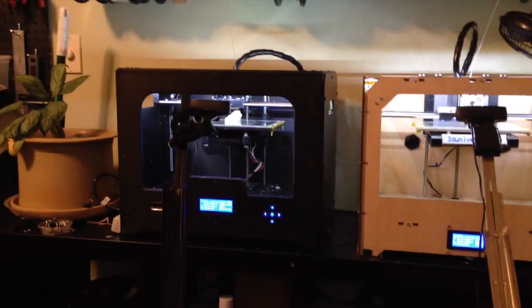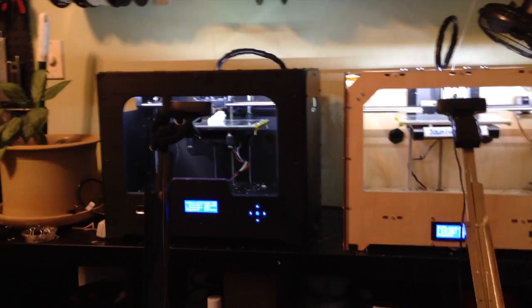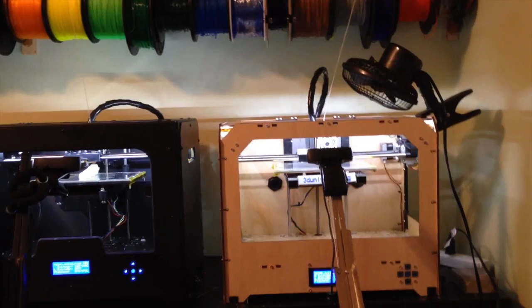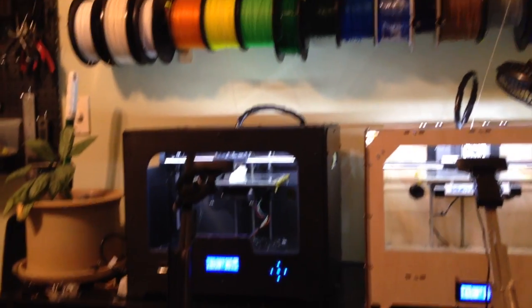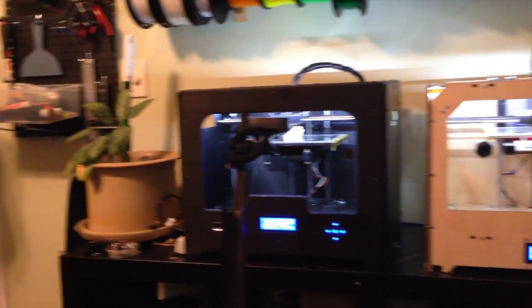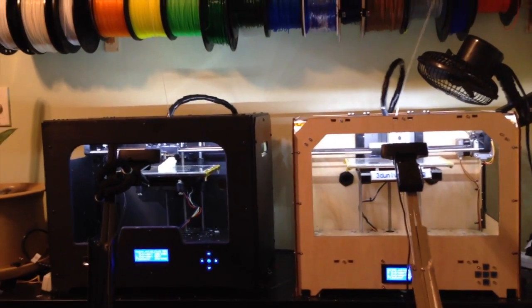Hi everyone, this is Jeremy Simon with 3D Universe. I was just doing a quick test here and I wanted to share the results with you live. I've got two test prints running here, one on the Creator on the right and one on the Creator X on the left. Both are printing the same thing — this is a test of a new finger design that a fellow ENABLE volunteer by the name of Skip Meats put together.